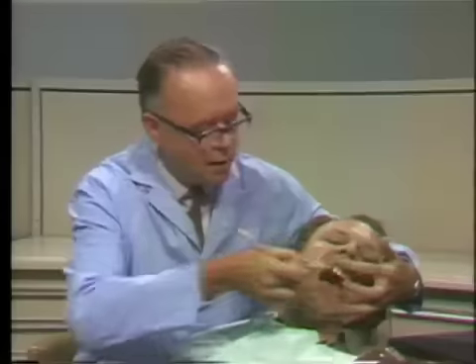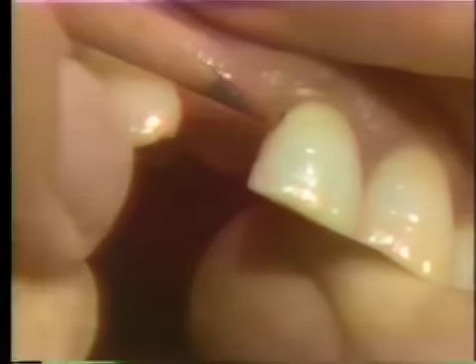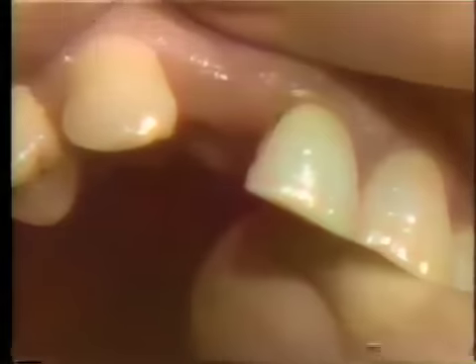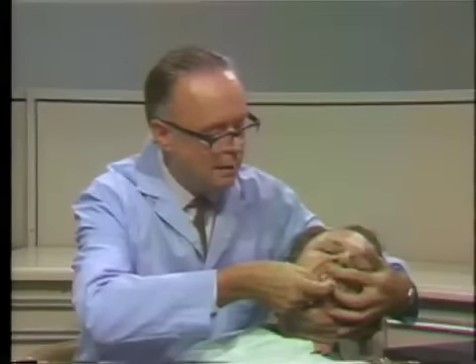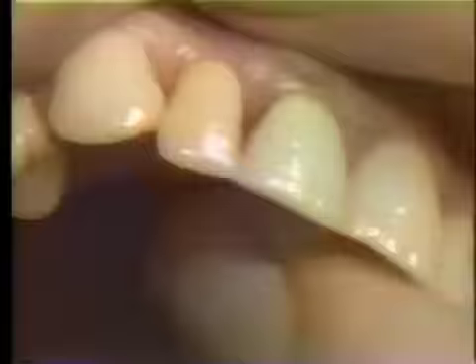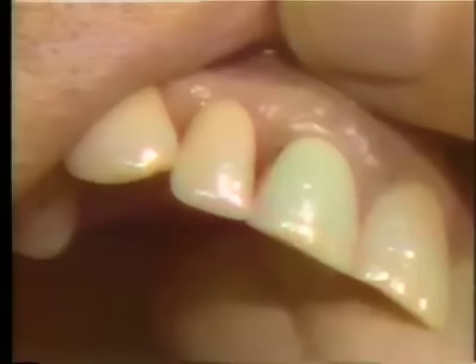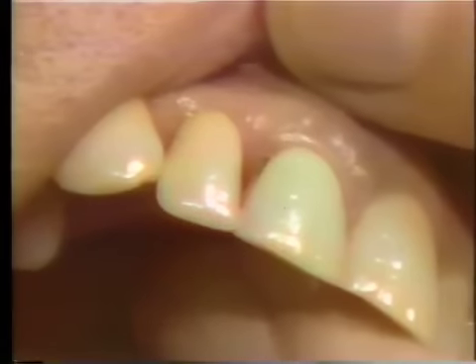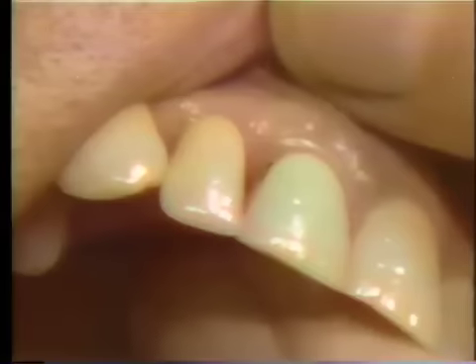in this case. And so what we now do is to take the facing out and then to draw another line on the proximal of this tooth, just about a ½ millimeter or so lingually to the first one. And then we'll pop this facing back again in here, and we'll take a look at that second line that we have drawn in there. And I'm not sure whether on the TV camera here you can just exactly see that, but from where I am, it's a sort of happy compromise that would bring the gold far enough forward for self-cleansing and for a good contact point, and yet would not be showing any more gold than is necessary.